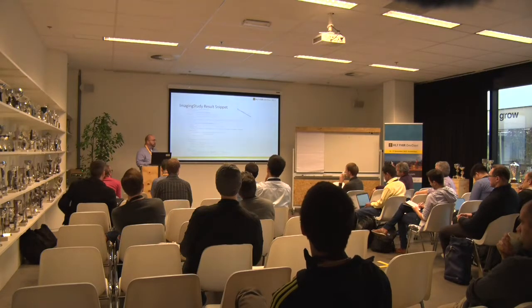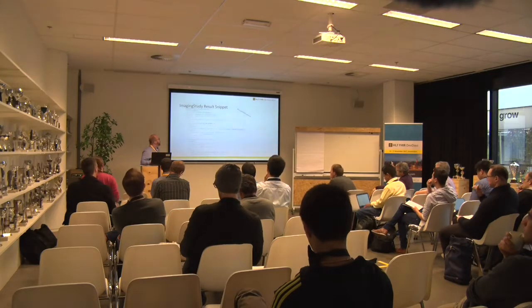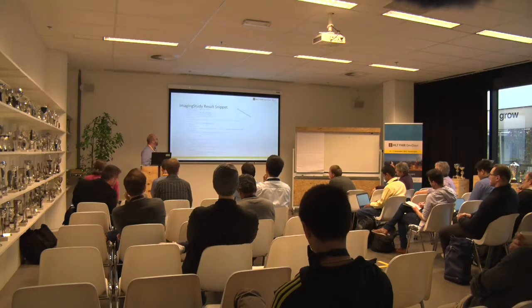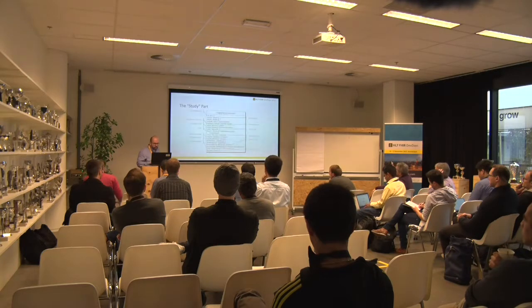Looking at a JSON representation, this is not a complete example, but the most important parts, for me at least, are the study, series, and instance UIDs, which I've bolded there. Those are those URN OID numbers that reference each of those different levels. But you can see things like the date timestamp, the patient reference, where I go to get to the study. Actually, I'll step through a little bit.